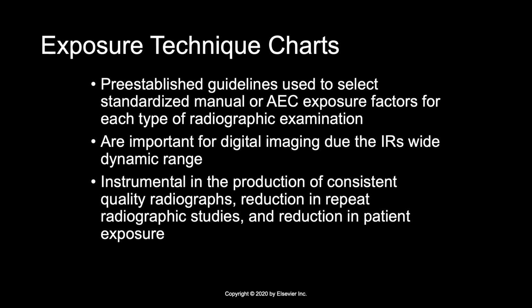When using digital IRs, we have to be very careful about preventing excessive radiation exposure to the patient. And it is our job as the RT or the radiographer to select the exposure factors that are going to produce a quality radiographic image, but using ALARA, giving the patient the minimal amount of radiation. Technique charts are very useful tools that help us select a manual exposure technique, or when we're using the AEC, and it doesn't matter what type of IR we're using.